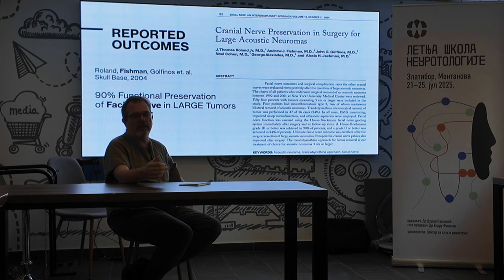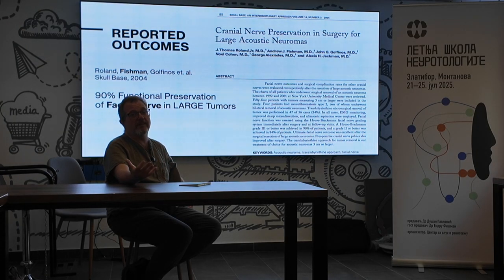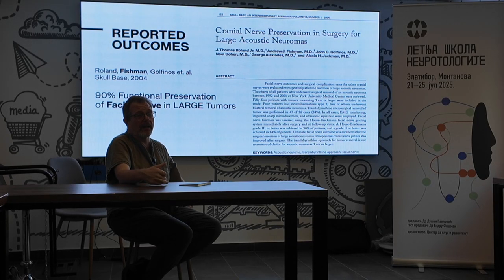So we feel it's reasonable to first make sure that the patient has some electrical stimulation. In many centers, they're just putting in the implant, which is an expensive test because some of these implants don't work. But we would like to make sure that they will work. So this is another thing, only for the last few years this is being done in the US and in Europe. So there are better ways to give back the hearing.